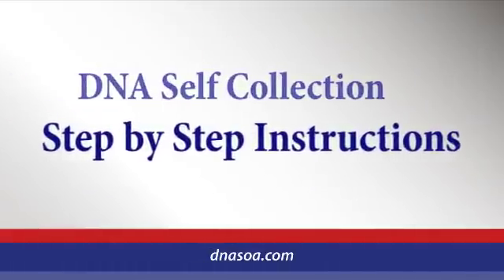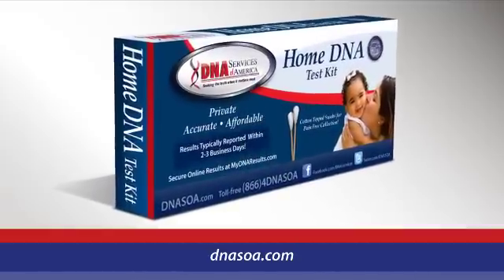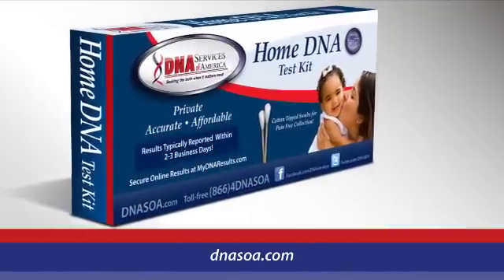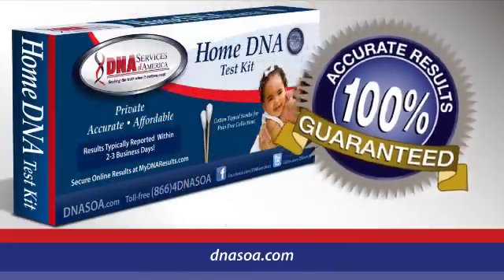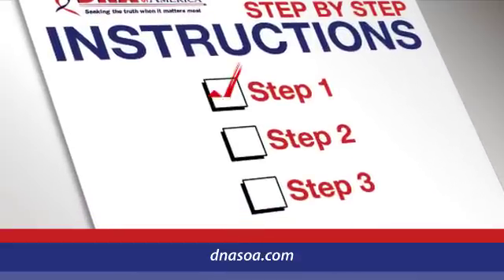With our home DNA test kit, DNA Services of America makes it easy to perform a self-collection that ensures you receive the highest quality, most accurate DNA test results. Simply follow these step-by-step instructions.